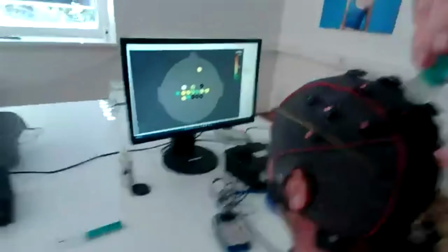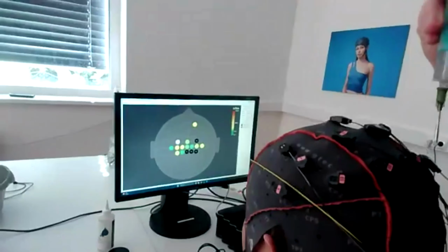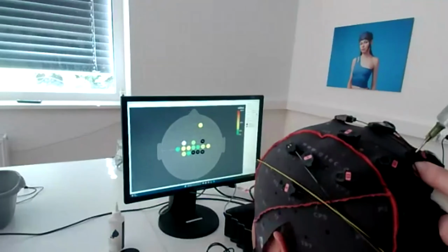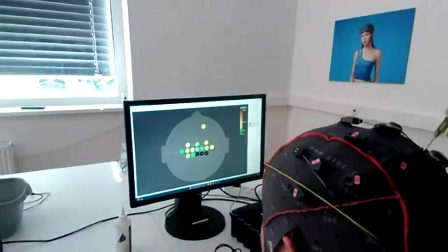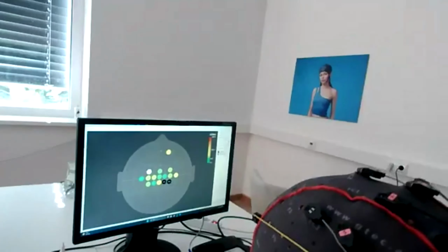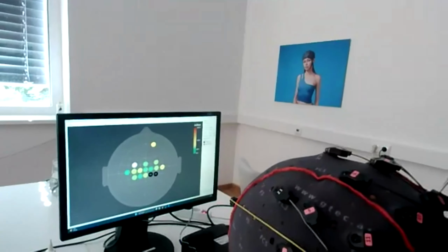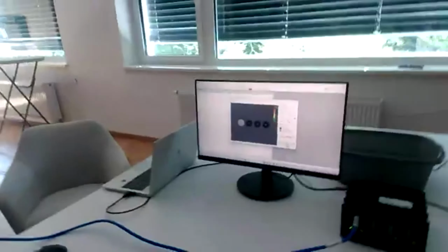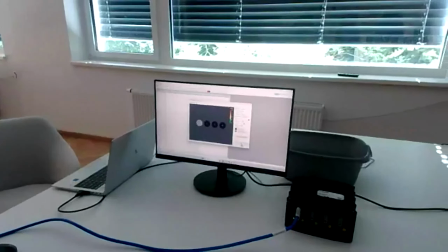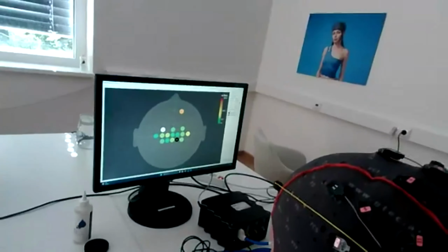You can see already most of the electrodes in green on the active electrode setup side. Montage is really nice because if you're completely lost, 16 channels is easy, right? But if you have 64 channels or something like that, and you're completely lost which of the electrodes is bad, then having a montage on the impedance check is highly important. On the passive electrodes, obviously we are using just 3 electrodes, so it's not highly important, but you can still put the montage if you want. You have to do it like I did it in the past.